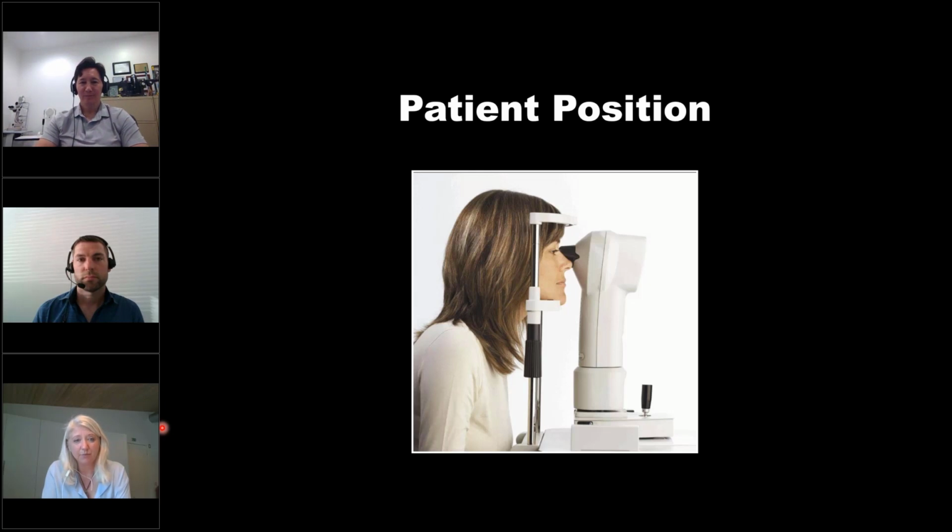I would prefer the patient to have the most normal position, but sometimes we need to adjust a little bit because of the nose, or if someone has very big bones over the eye, so they must be sitting as normal as possible when you do the capture.